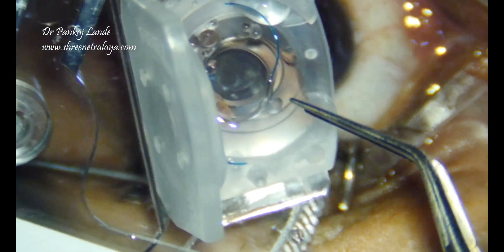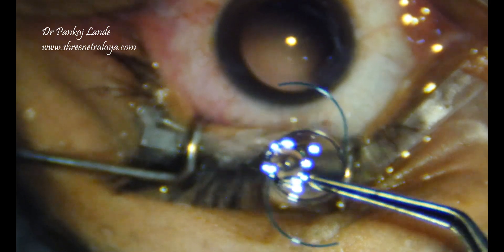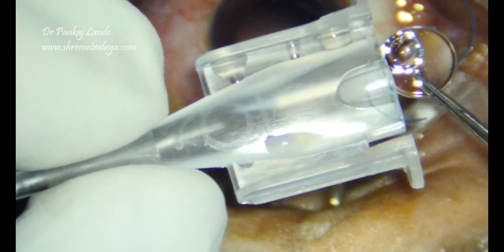Here I am showing a demonstration of how to implant a Sensor J&J IOL 3-piece IOL through a single-piece cartridge from J&J.